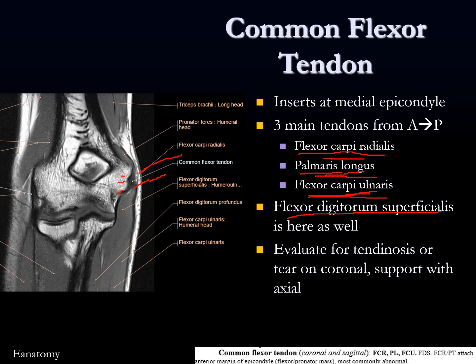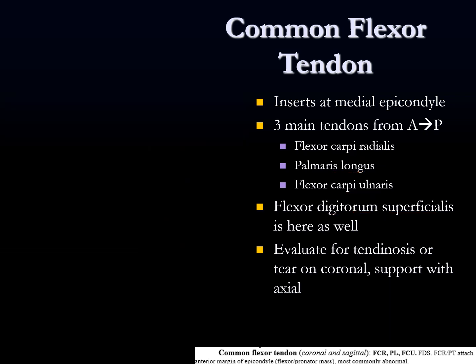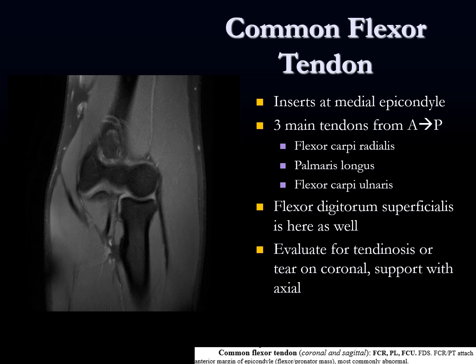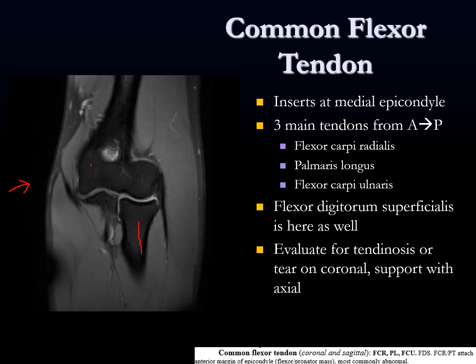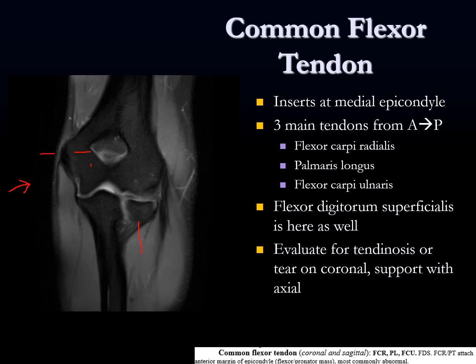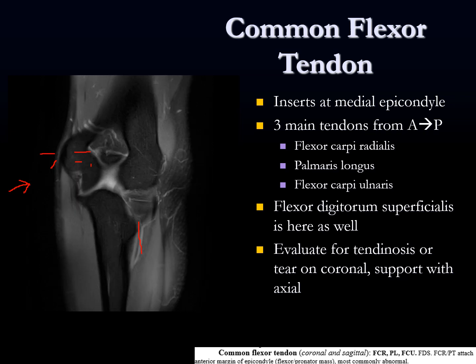Almost all the time you're going to say common flexor tendon origin tendinosis or common flexor tendon origin partial tear, without trying to separate out the individual tendon parts. The axial is the other sequence that can help support your findings — if you think there's an abnormality on the coronal, correlate with the axial. On our scrollable images we're looking for the common flexor tendon on the fluid-sensitive coronal. Here's a nice normal dark attachment at the common flexor tendon origin with no concern for partial tear or tendinosis.